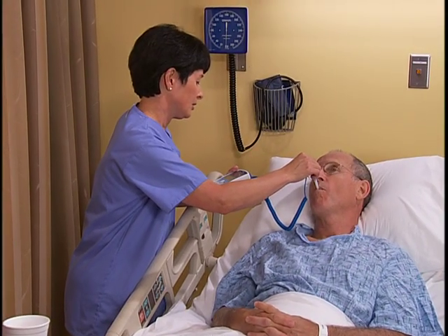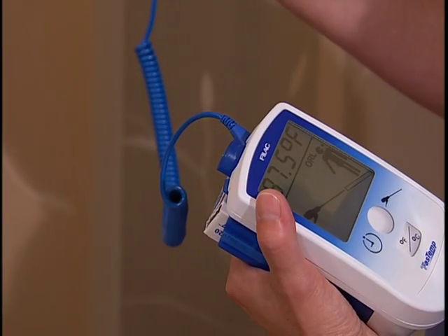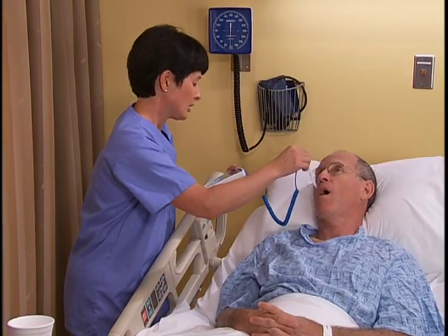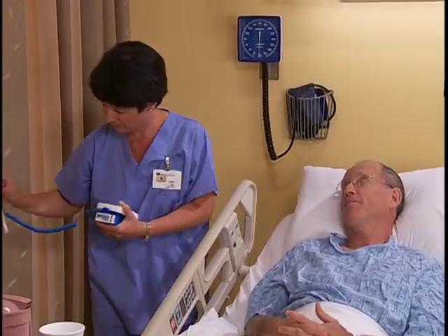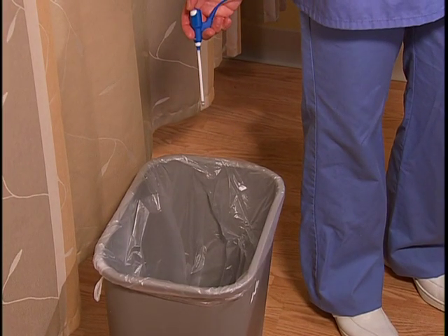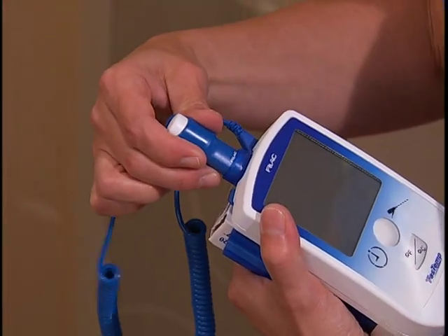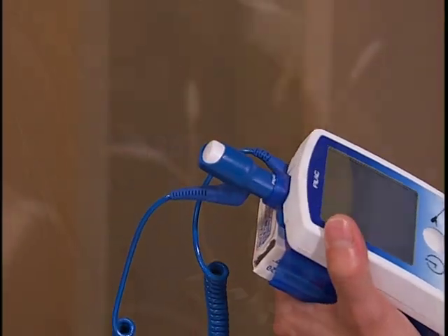Keep the probe in place until you hear the completion signal and see his temperature on the digital display. Then remove the probe and tell the patient his temperature. Push the ejection button on the probe to discard the probe cover into an appropriate receptacle. Return the thermometer's stem to its storage location and return the thermometer to the charger.